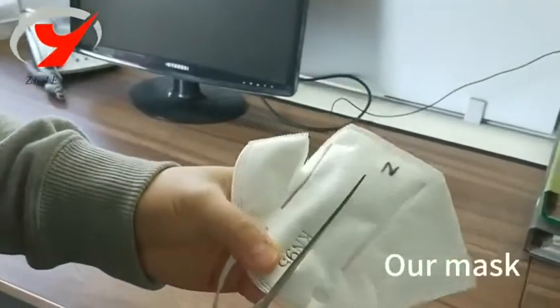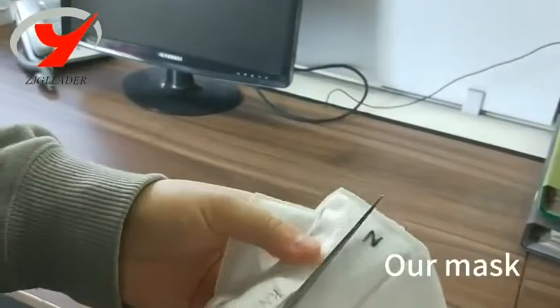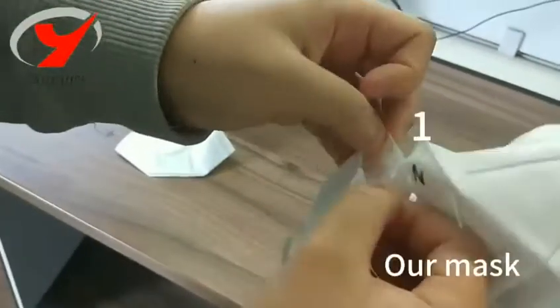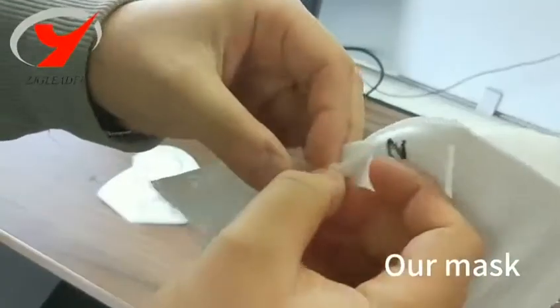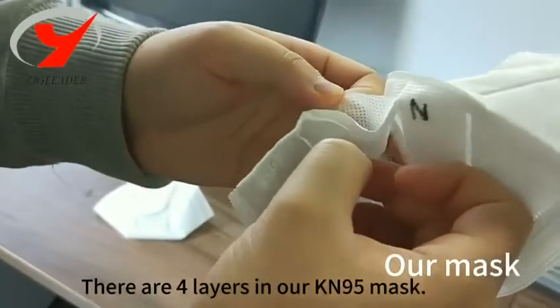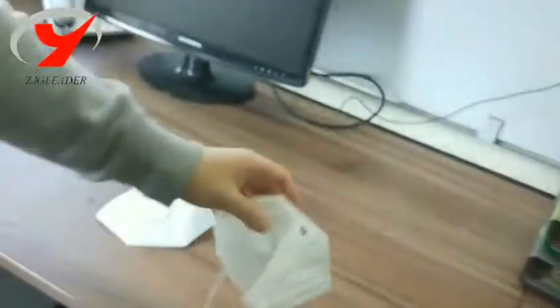This one is ours — have a look at the cut from the middle. Have a look around: the total layers is one, two, three, four. There are four layers in our Rakiya 95 mask.